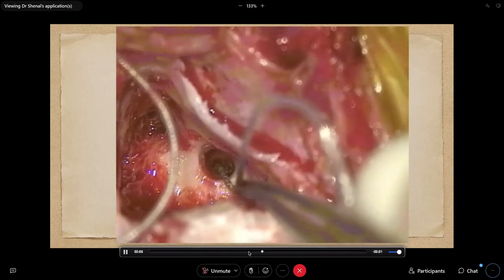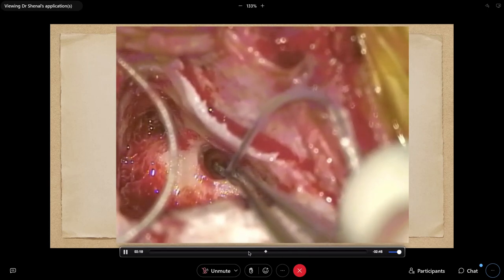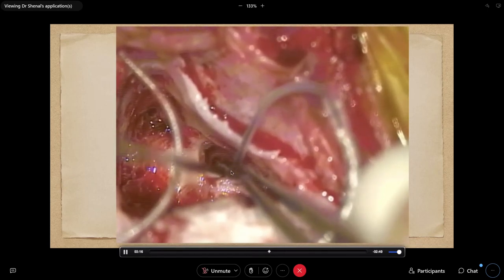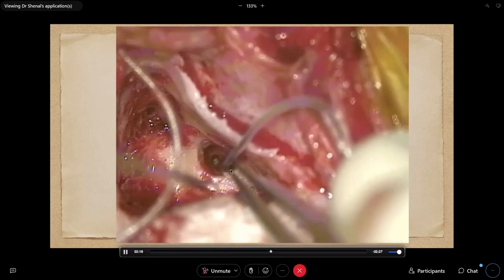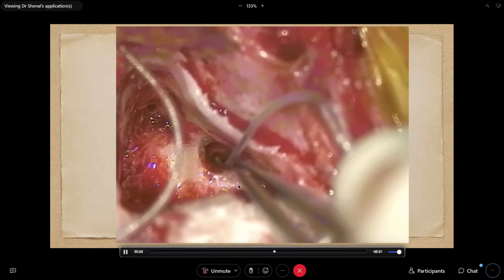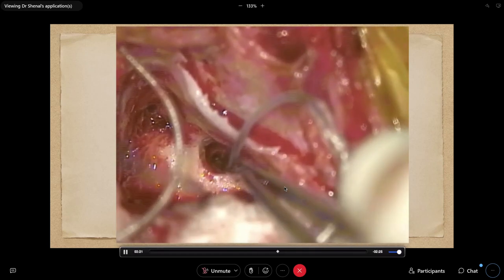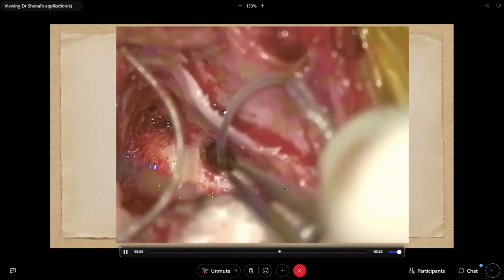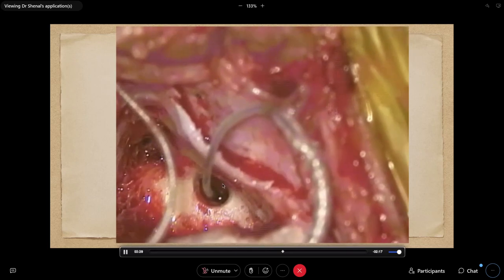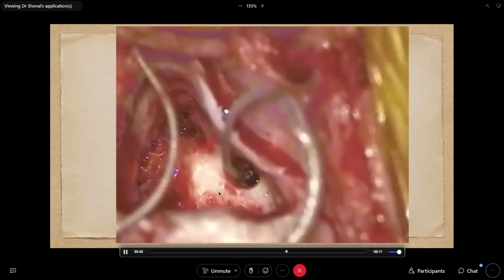Every manufacturer has their own specifications as to how much electrode can be put into the cochlea. Once we have met that level, you can see here the mark has been coming on the border of the posterior tympanotomy, and now we will seal it with the soft tissue. The soft tissue stops any gusher, any CSF leak or perilymph leak. At the same time, it will help us to keep our electrode fixed there. So the chance of it coming out, getting extruded, is also minimized.